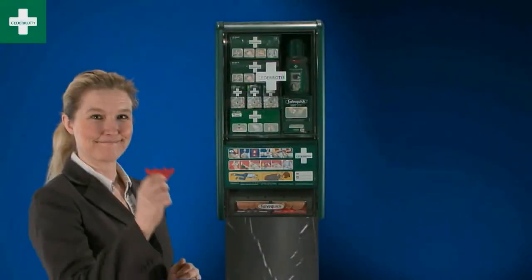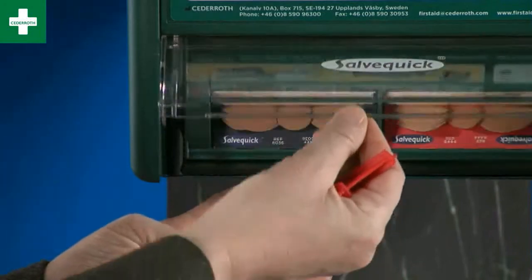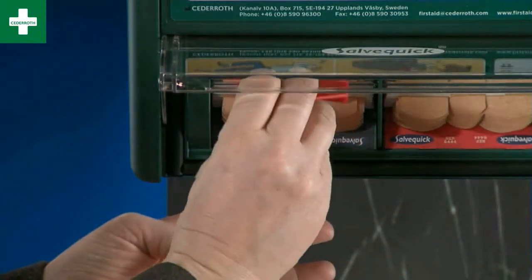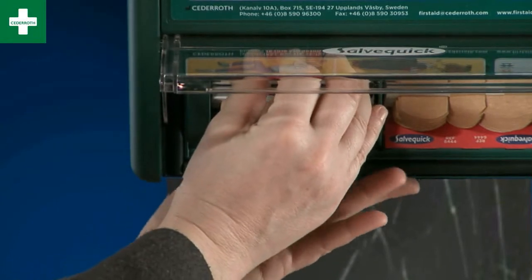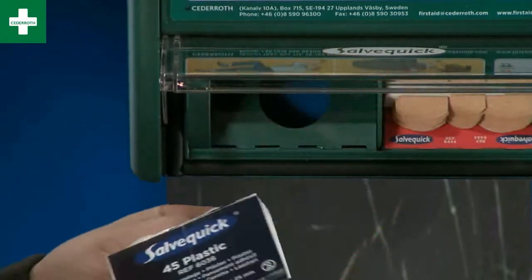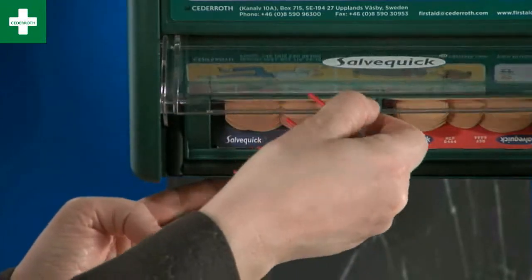When you need to change the Salva Quick Plaster refills, find the red key that was delivered with the station. Press the four pins of the key down into the four holes above the refill, at the same time lifting the refill from below with one finger. When you put the new refill in, you just have to push it into place.